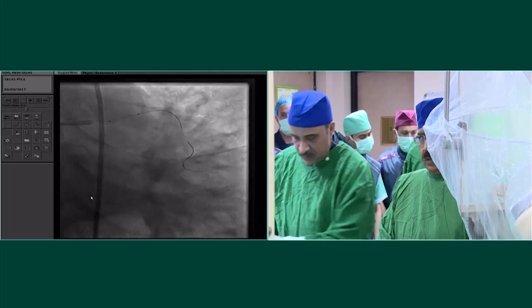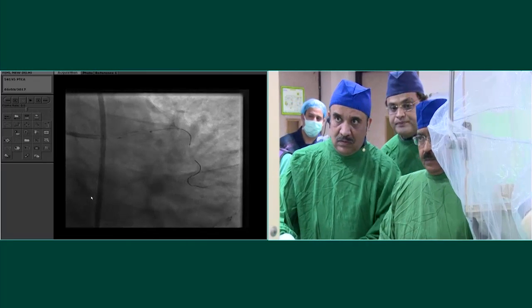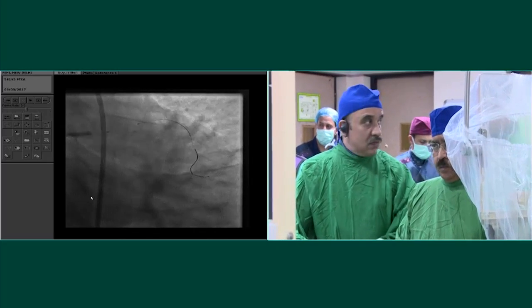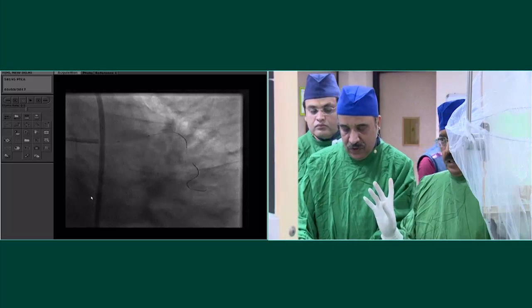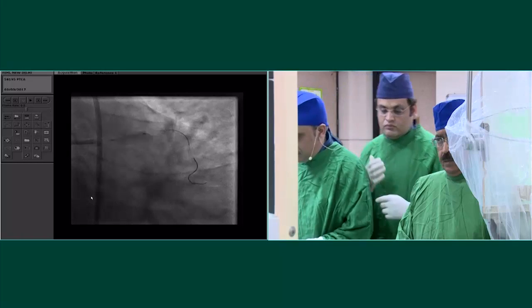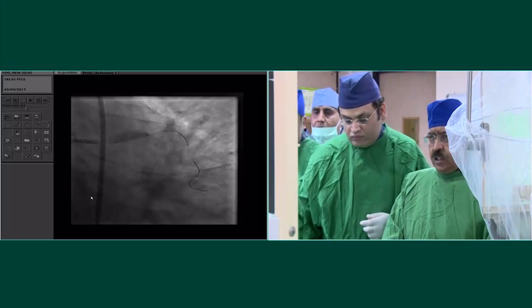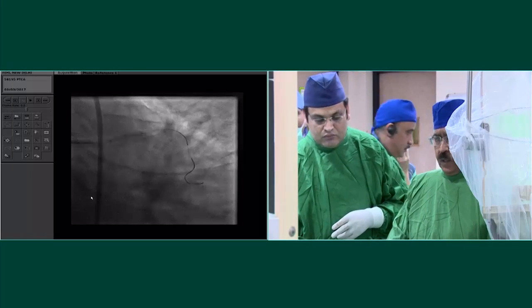Okay. Vijay, you could be looking here. Okay. Go up. 4, 2. Little bit. 4. That seems a good size. You see, these are soft lesions. It's not holding back. Deflate.